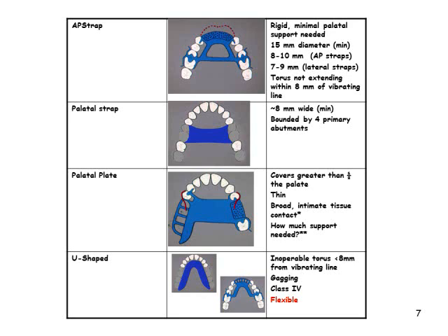The anterior border follows valleys of rugae and crosses the arch at a right angle to the midline. It does not extend anterior to the fulcrum and/or the indirect retainer. The posterior border is located at or anterior to the vibrating line. It does not extend onto the soft palate. It is extended to the hamular notches in the extension base partial. Finishing lines are no farther medially than 2 mm to an imaginary line which would contact the lingual surface of the missing natural teeth.